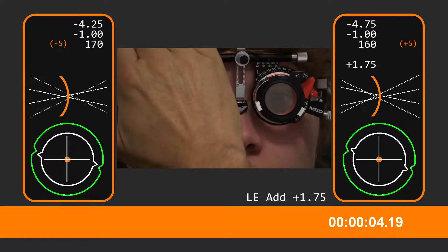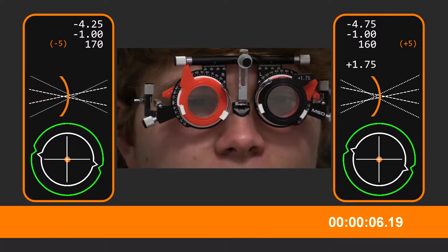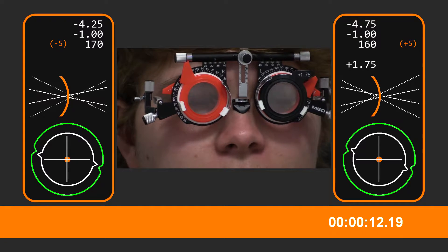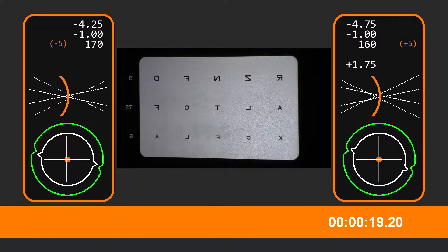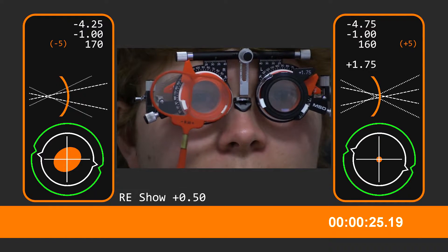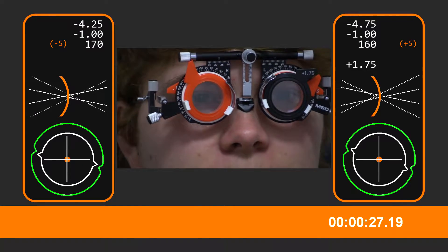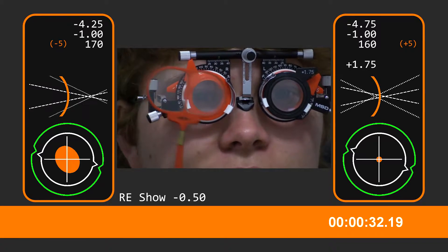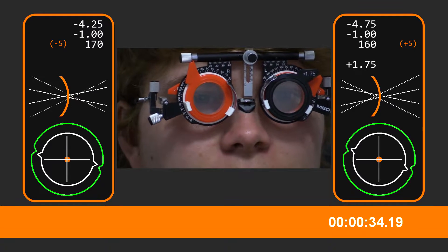All right, a bit blurry. Now we're going to work on the right side. I want you to keep both eyes open. Have a look at some letters. See that top line there? If you look at those letters, better with this one or better without? Without. That one or without? Not much in it. No, there's not much difference.